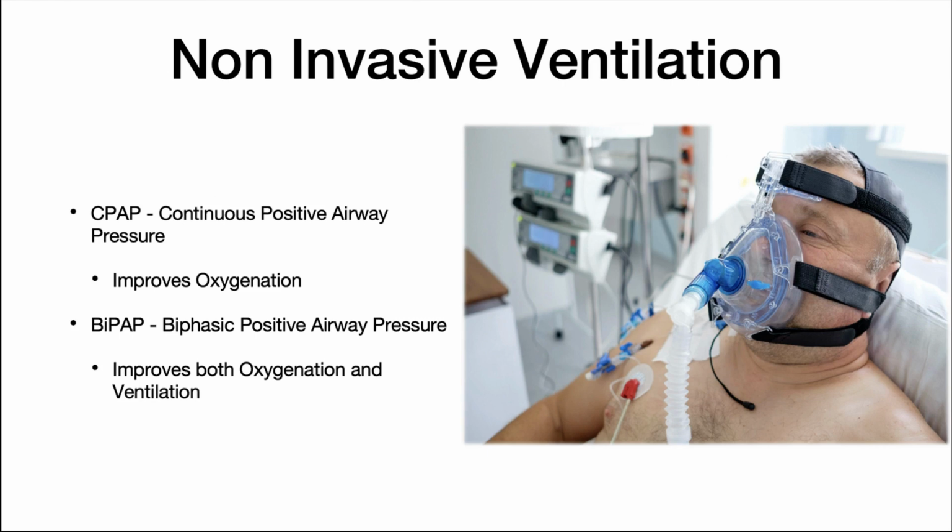And finally, just a discussion on non-invasive ventilation. So we have two modes essentially of non-invasive ventilation. We have CPAP, which provides a continuous positive airway pressure, and the best analogy for this is that if you stuck your head out of the car window driving at 100 km an hour, that constant flow is like a CPAP. BiPAP stands for biphasic positive airway pressure, and this improves oxygenation and ventilation, whereas CPAP only improves oxygenation.